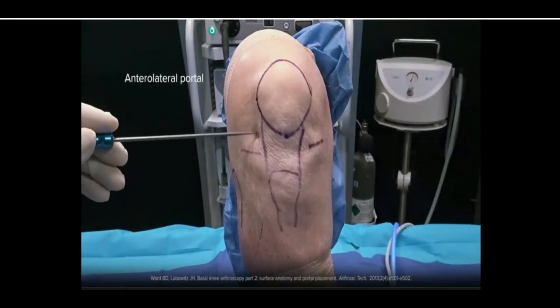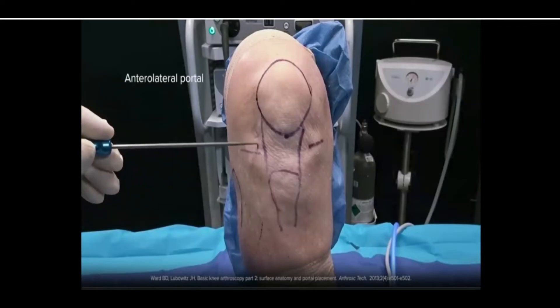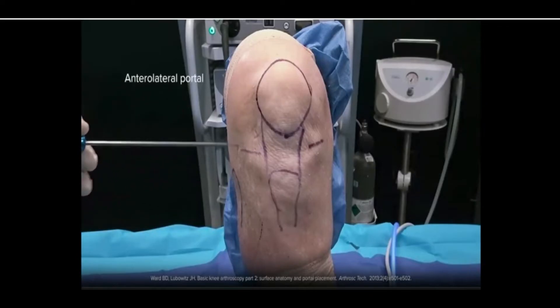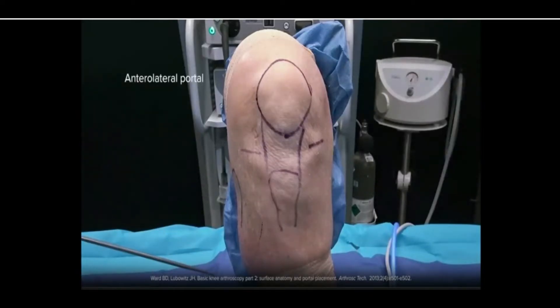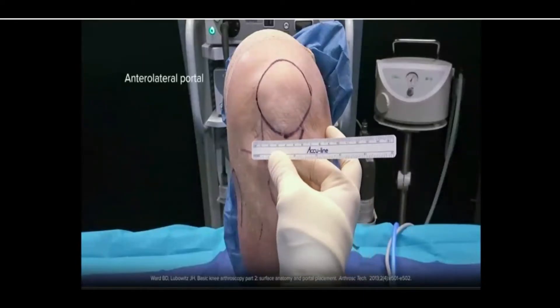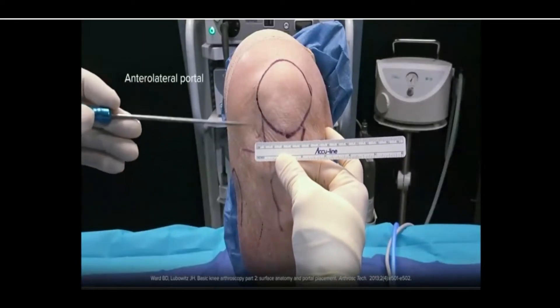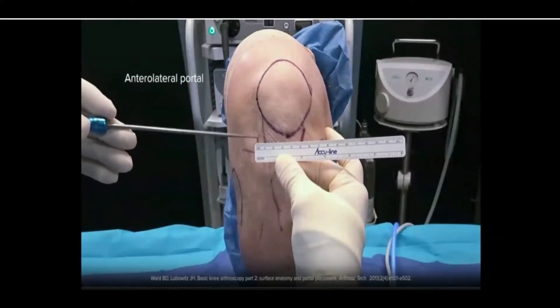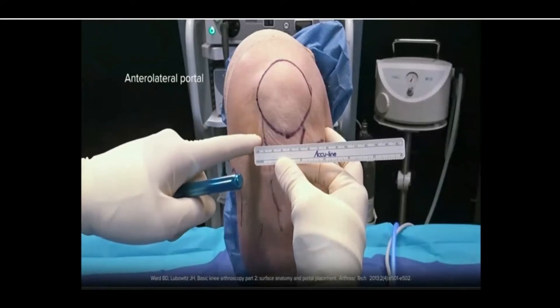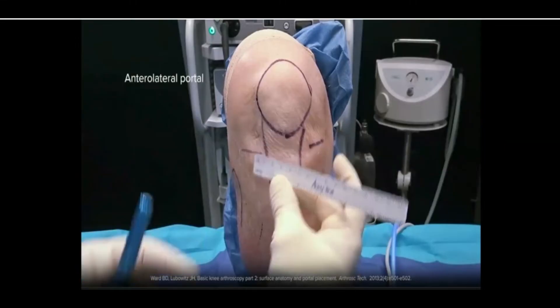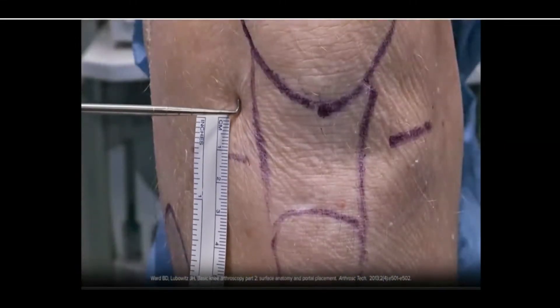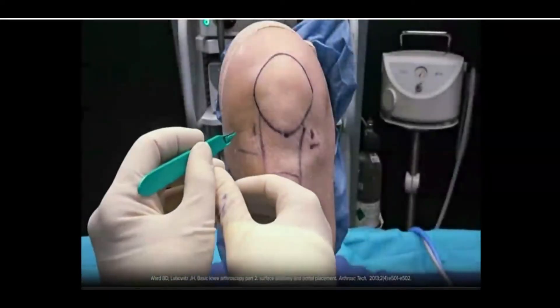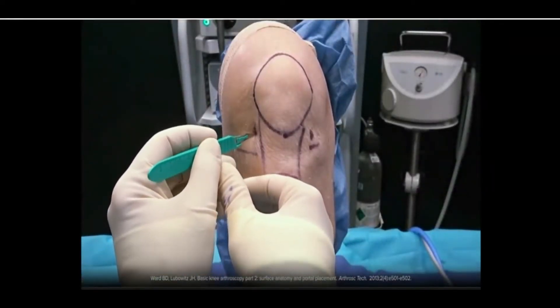The anterolateral portal is placed first due to the decreased likelihood of injuring the meniscus, as its anterior horn sits slightly more posterior on the tibial plateau than that of the medial meniscus. The anterolateral portal is made adjacent to the lateral edge of the patellar tendon and above the joint line in the palpable soft spot, approximately one centimeter lateral to the patella and one centimeter above the joint line. This is done with a number 11 blade and a small stab incision.